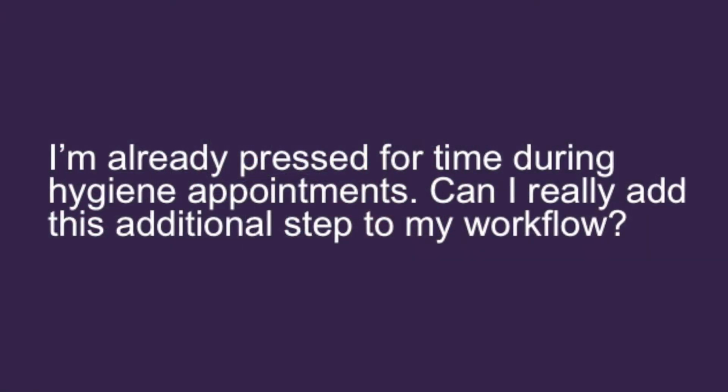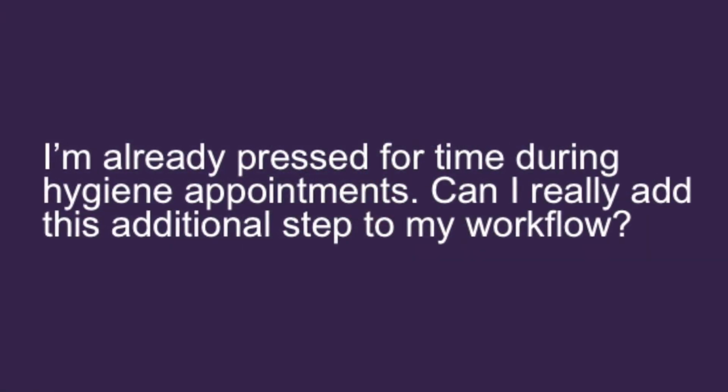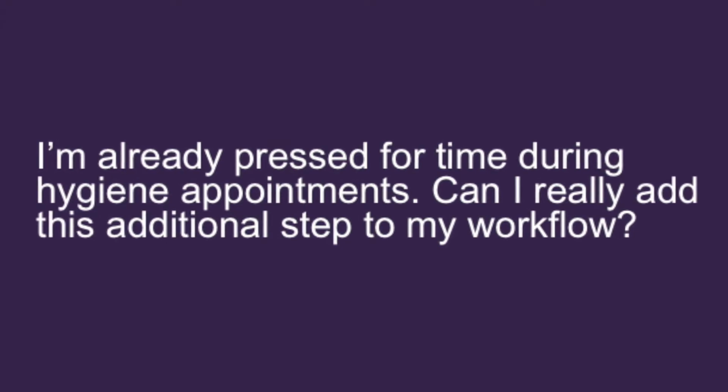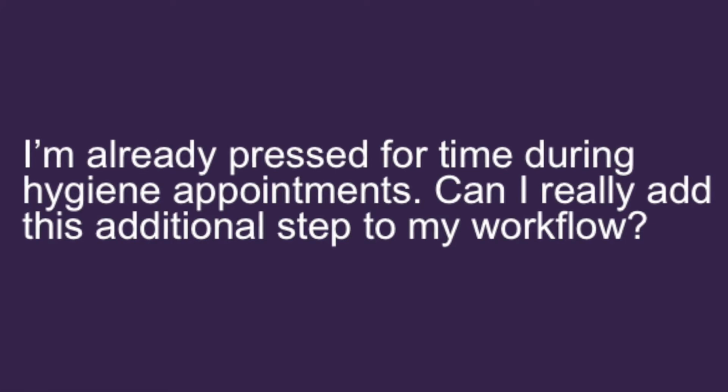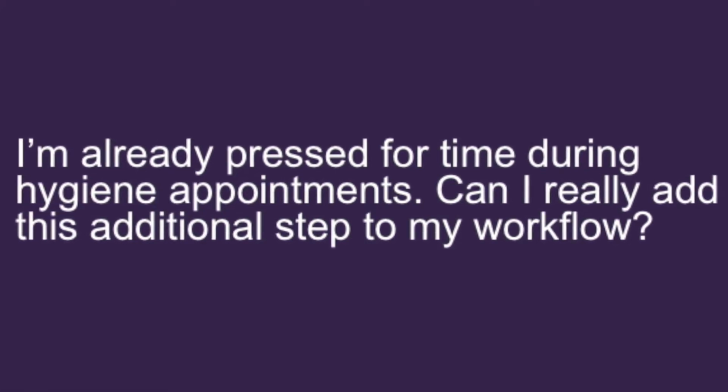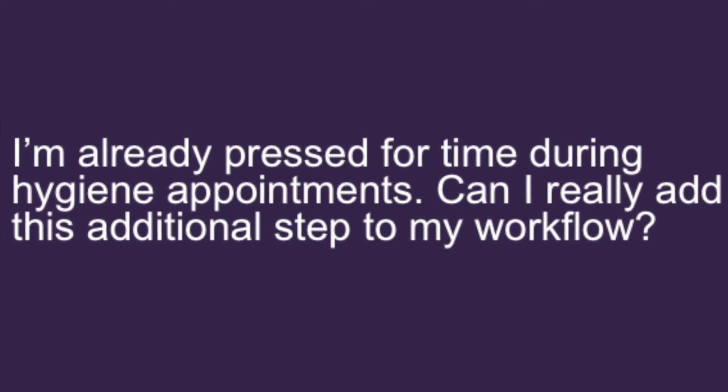It is important that the hygiene team become experts in scanning patients for records. The goal for all scans should be 5 minutes or less. With training and practice, this is easily attainable. We recommend collecting a scan on every patient at least once per year.